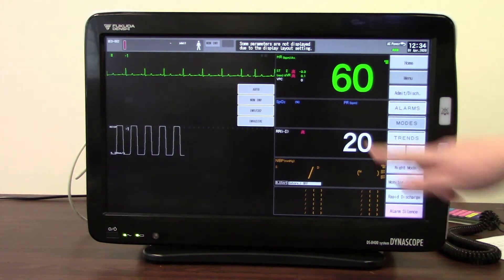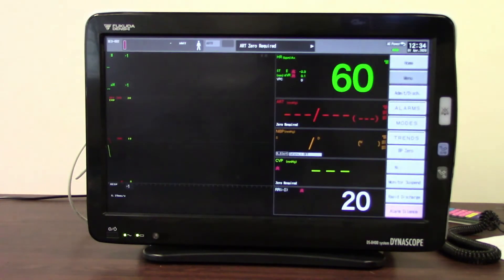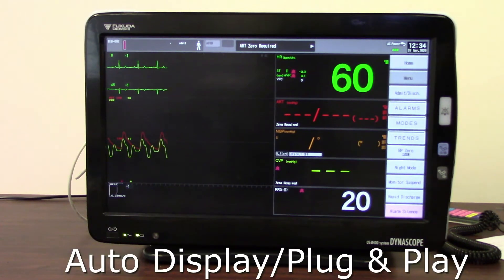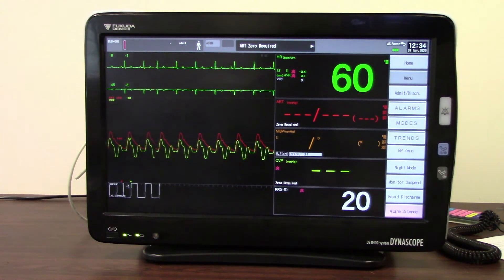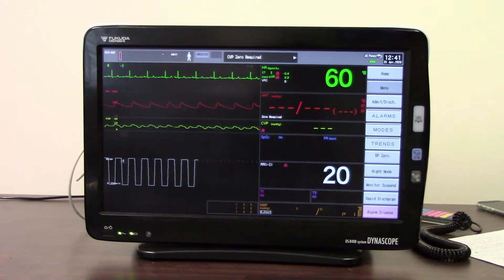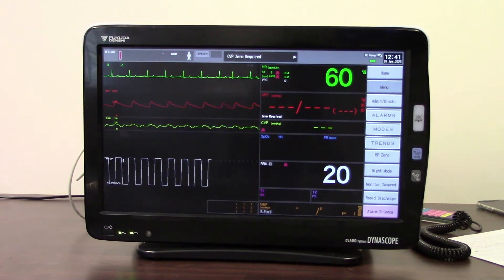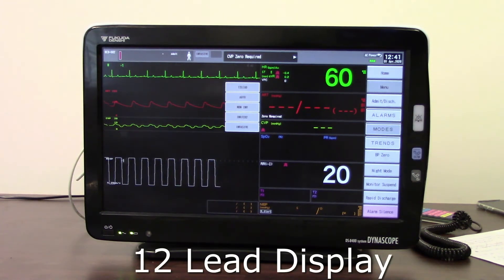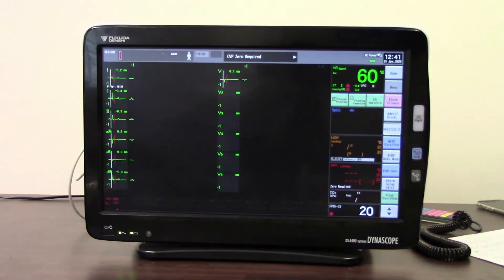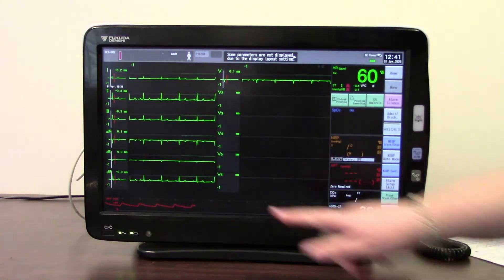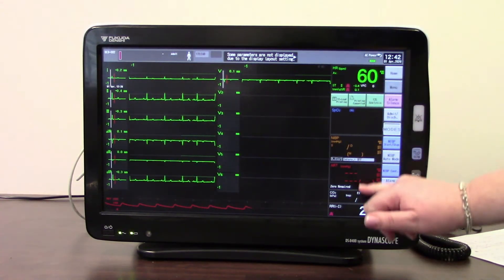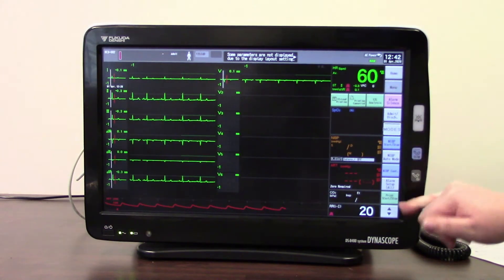The other display that we've got showing is the auto display — this is our plug and play display, which will show you whatever is plugged into the monitor. Anything that's unplugged will disappear. The other display you may want to access is the 12-lead display if you have that function on your monitor. Selecting the 12-lead will show my 12 leads, a choice of another waveform, and still access to my parameters and user keys.